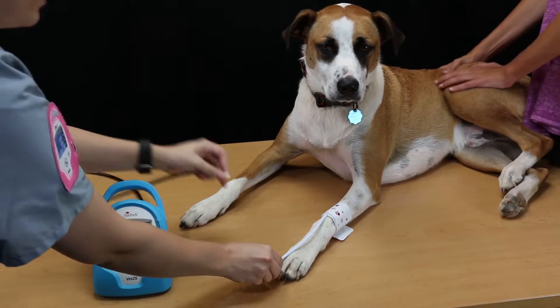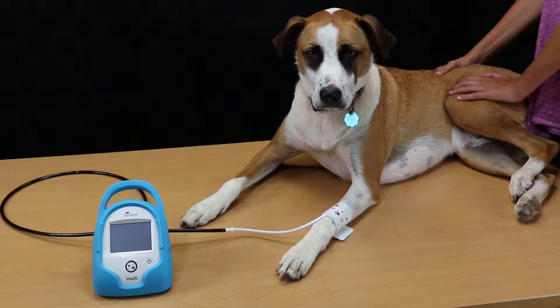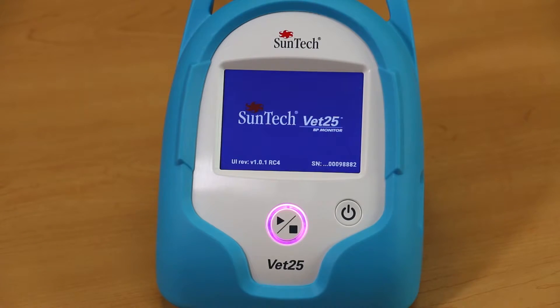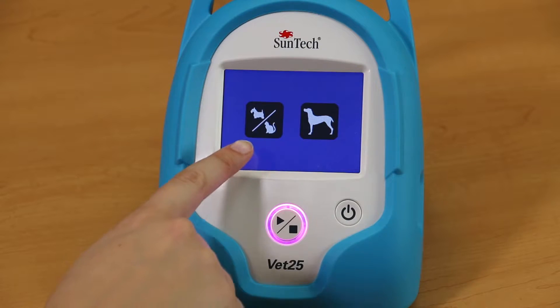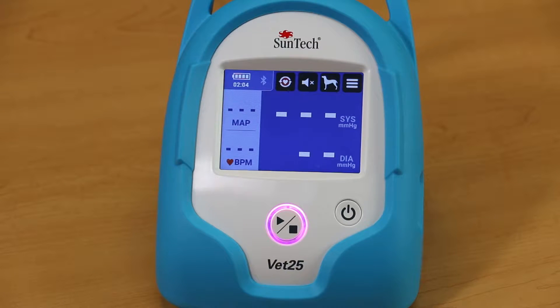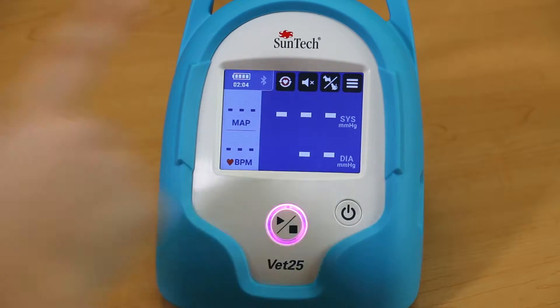With the proper cuff in place, connect the cuff to the patient hose of the SunTech VET25 Spot Check and Continuous BP Monitor. Turn on the monitor and select the size of the patient you are monitoring. Small animal mode should be chosen when taking BP measurements on cats and dogs up to a number 3 cuff size. Large animal mode has been designed for animals requiring a number 4 BP cuff or larger. To switch modes on the main screen, just press the Animal Size button.